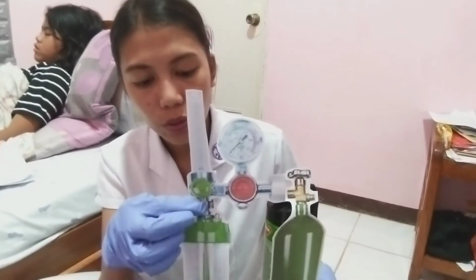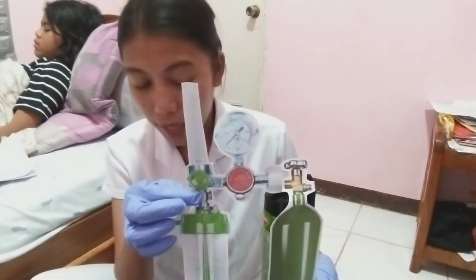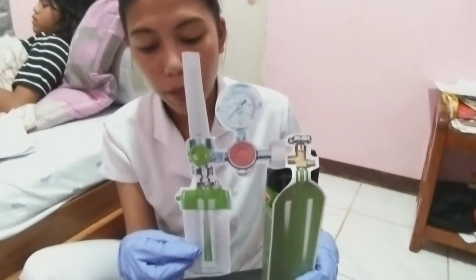If needed, fill the humidifier with sterile water and attach the humidifier at the base of our flow meter. So here is our flow meter and this is its base and this is our humidifier bottle.